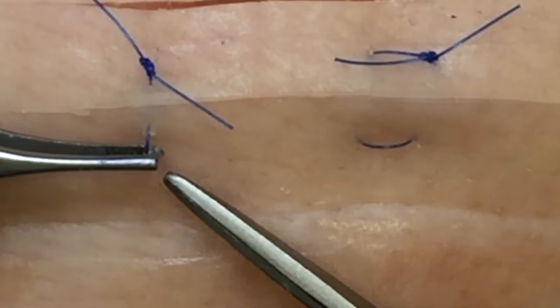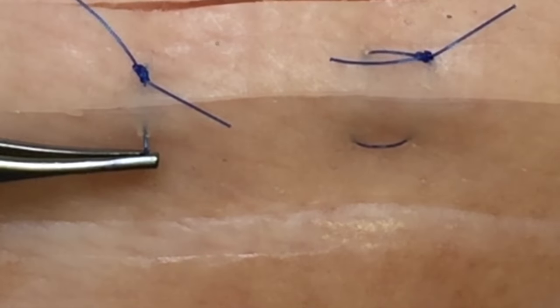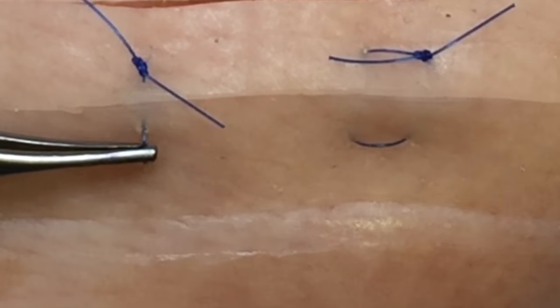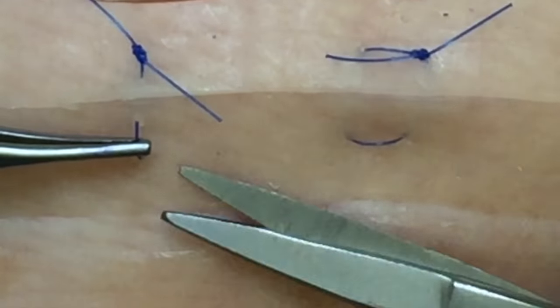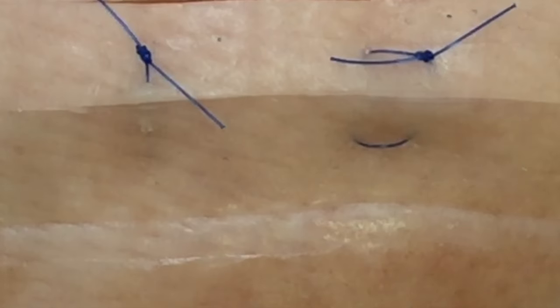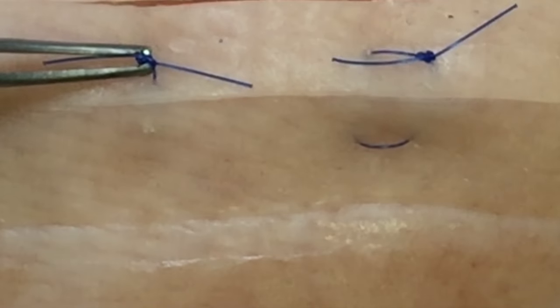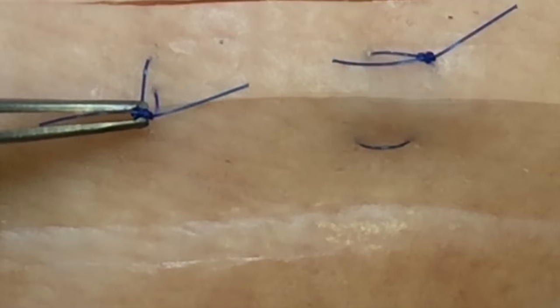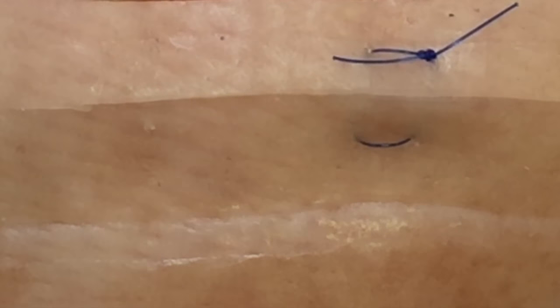Place your forceps underneath the suture as I show here. This is often easier with a pair of toothed forceps. You then want to divide each end of that part of the suture flush with the skin and, holding the knot, pull this back across the wound so that you are not applying force that opens the wound up.